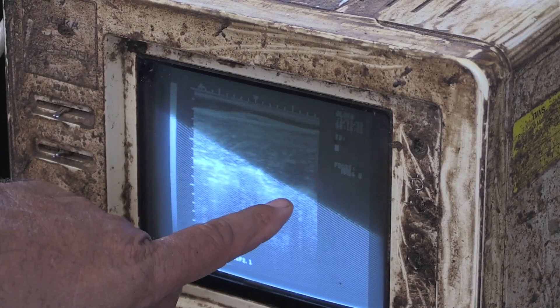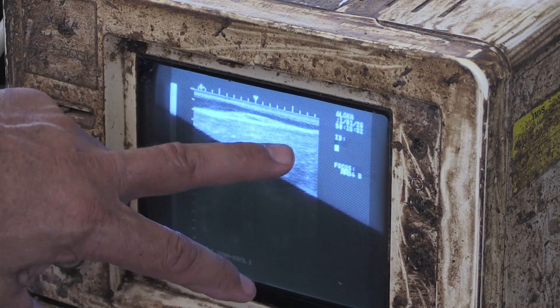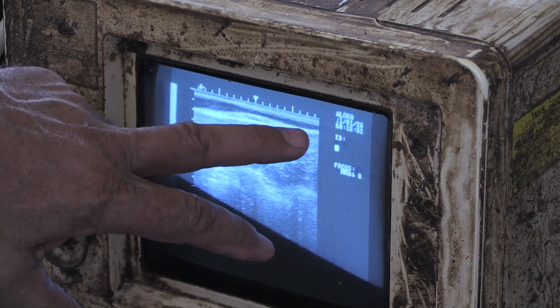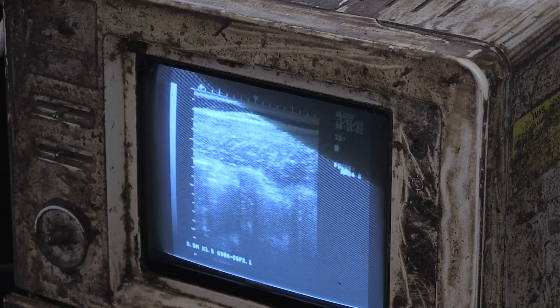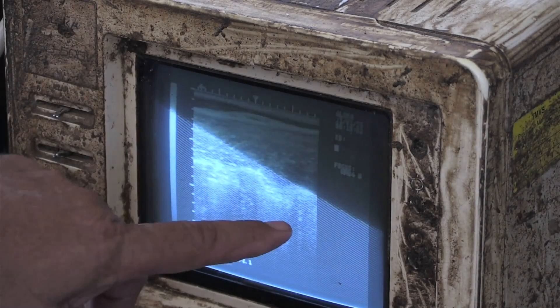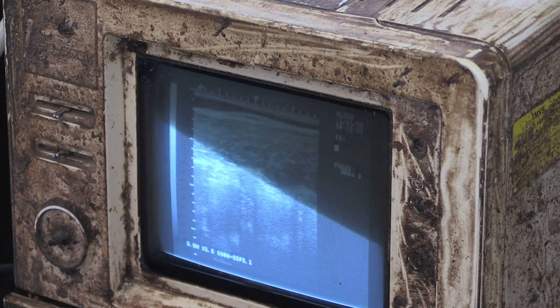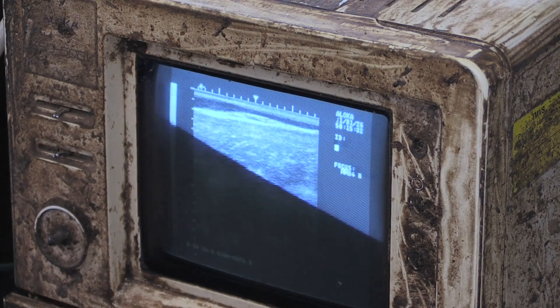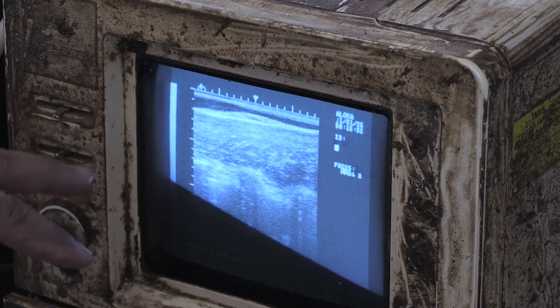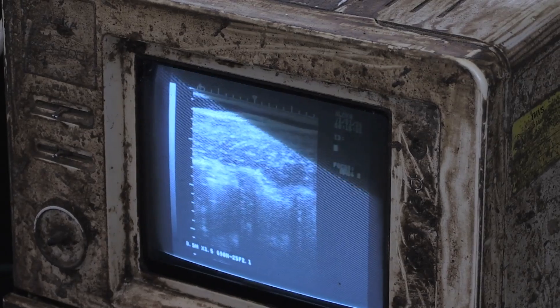You're looking for the last three ribs — this is your 13th, 12th, and 11th rib — and you can see up top is the hide. There's your back fat that we saw in the rib eye image, and this is shooting long ways through the muscle. These are the tops of the last three ribs, and we're going to measure the amount of marbling between these last two ribs. I'm going to collect at least four or five images, get a reading on each one, run an average, and that's where you come up with your average intramuscular fat per animal.